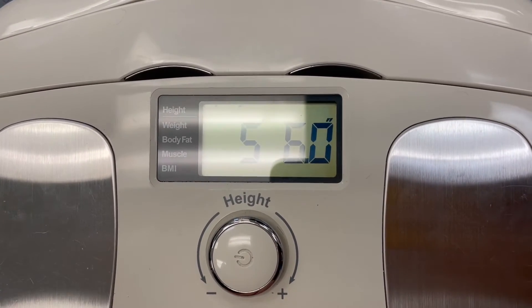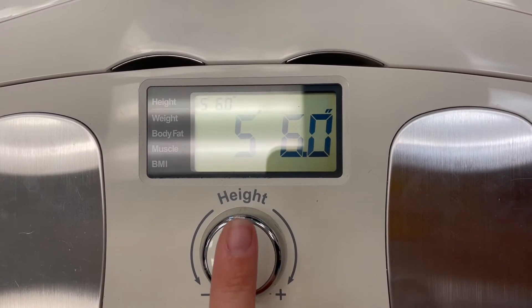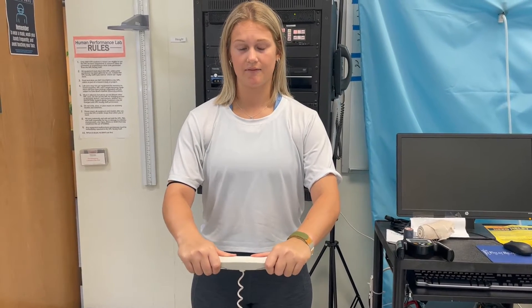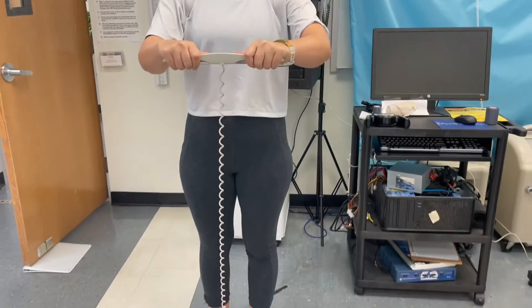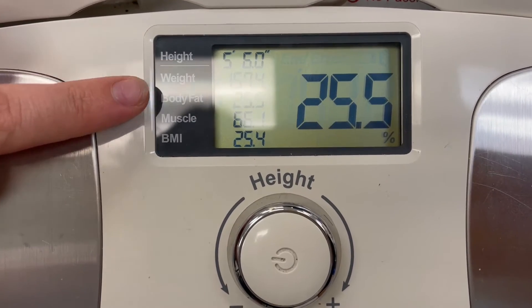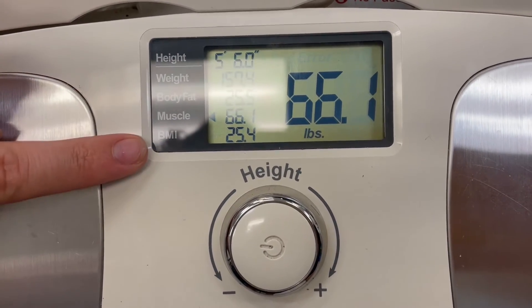Now that we know the subject's height, we can enter it into the scale. Press the middle and roll the dial as needed to find the height — for this subject, five six — then press the center of the dial. Once the scale is calibrated, your subject needs to know how to hold the bar properly: thumbs on the metal tabs and fingers wrapped around the metal on the back. Make sure to have your socks off for this test. Once everything is all set, step on and hold this position. At the end of the test you'll see weight, body fat, muscle, and BMI. For this lab we care about body fat and BMI, so be sure to record these numbers.